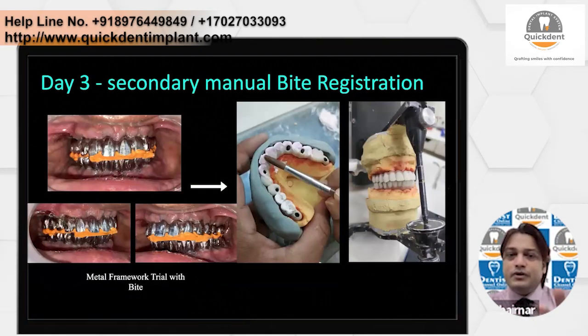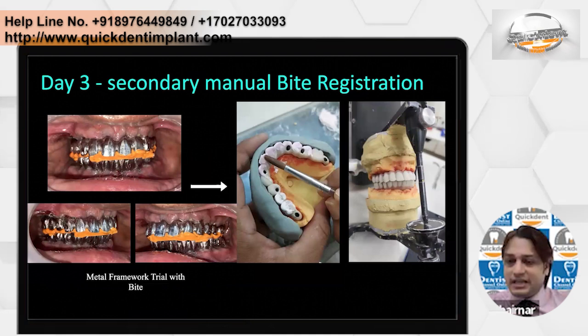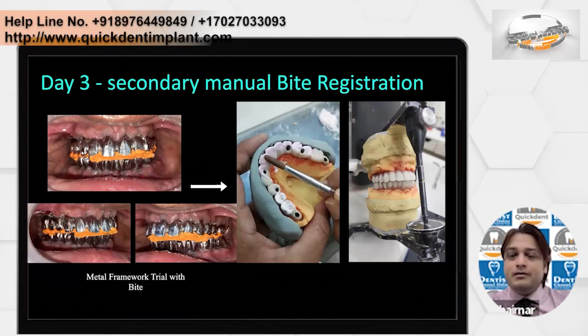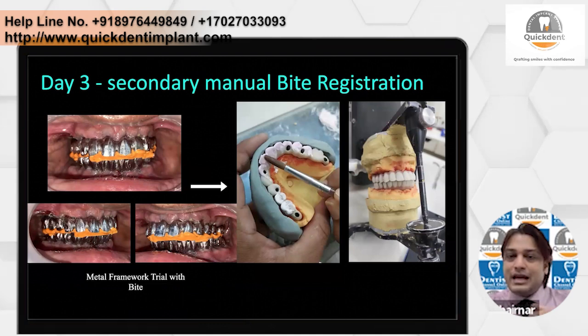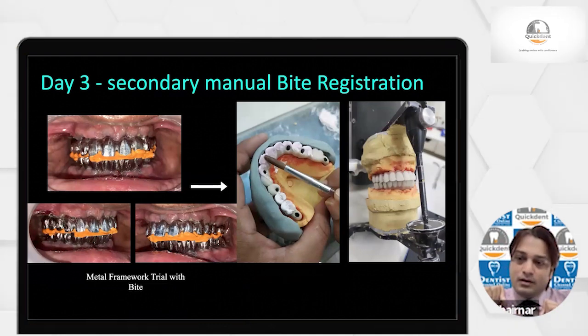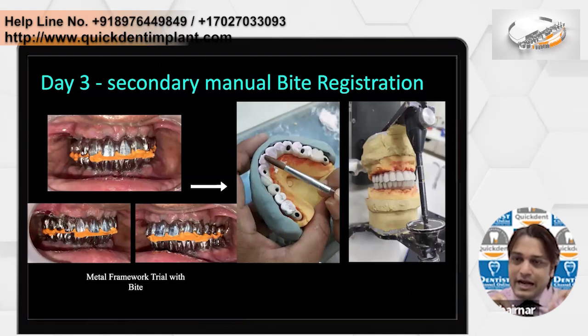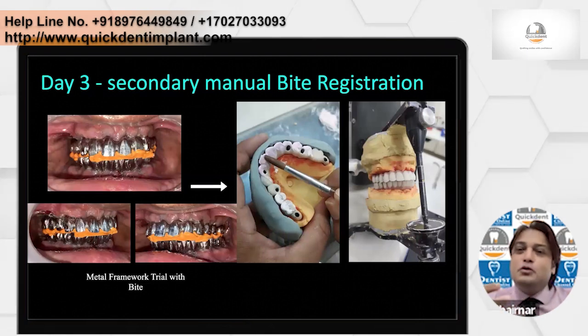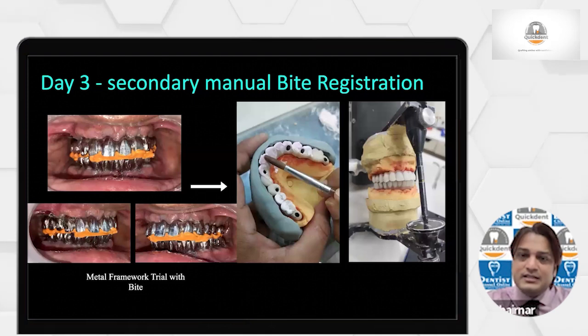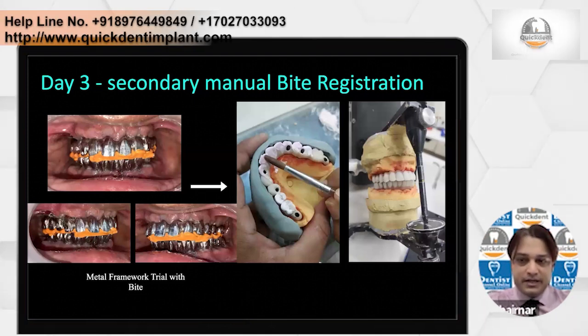We take the bite, and this bite we send to the technician. Why? Because for ceramic, there has to be physical mounting so that they can build. It is not a milled part. Anything which is milled, sometimes you don't need a bite at all. You'll see that in a few further cases. But here, definitely some building is there, so definitely the mounting is needed. So here, the first time we will send the physical bite.